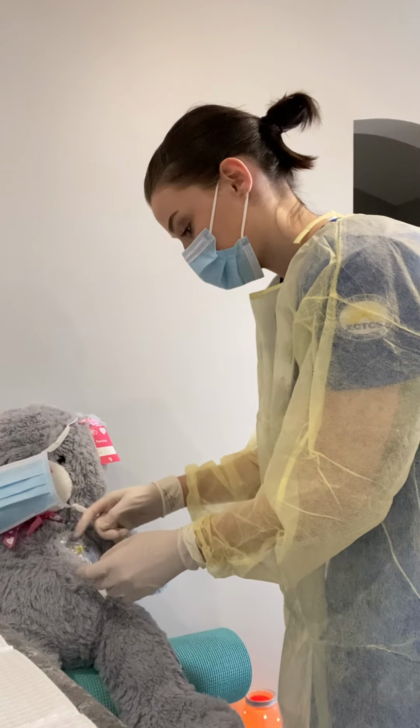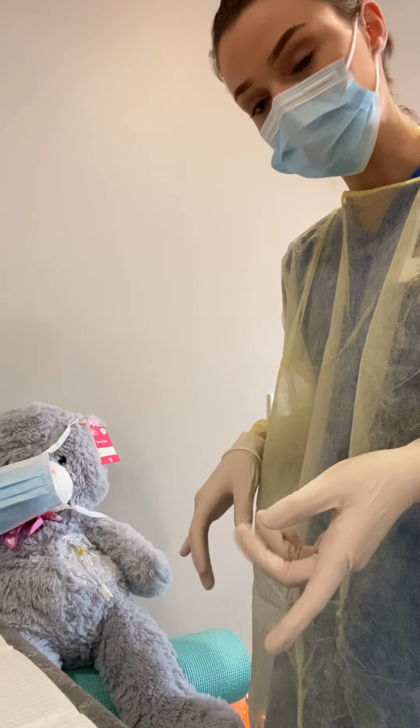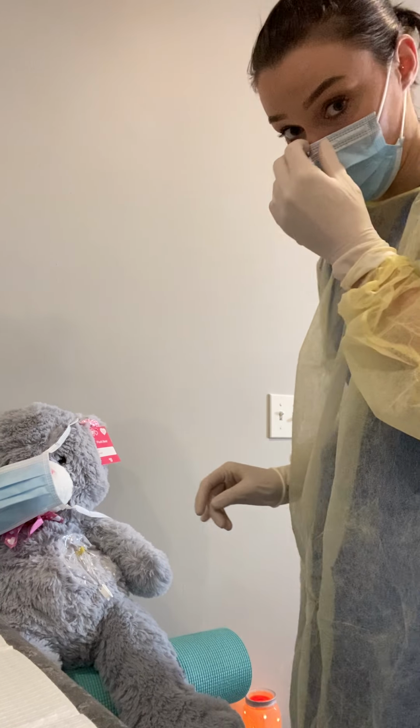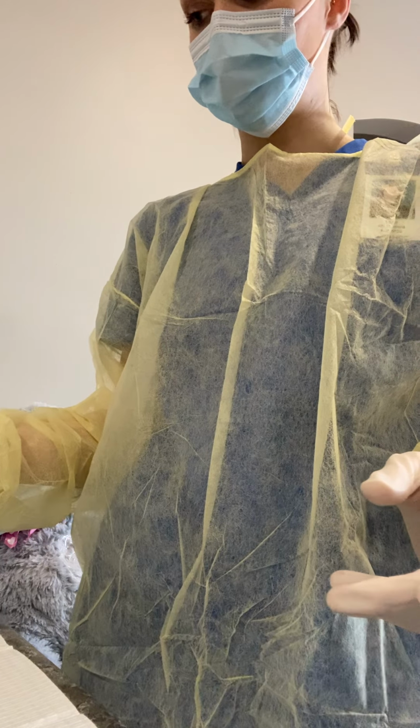Okay. Before we do that, I'm not going to do that first. Before we do that, I'm actually going to verify my placement. She had IV fluids running, but I'm still going to verify.